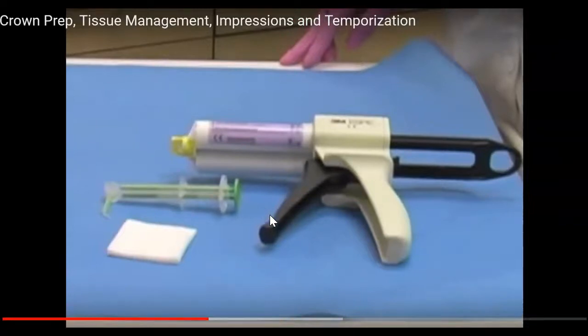So here they're going to start the process. The teeth have been prepped. What they're going to do is then take the final impression. Usually the preliminary impression is taken using heavy bodied material, and the heavy body material is going to be a lot thicker. We then use the light body material for the final impression.